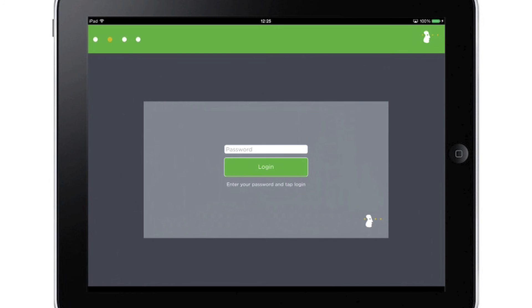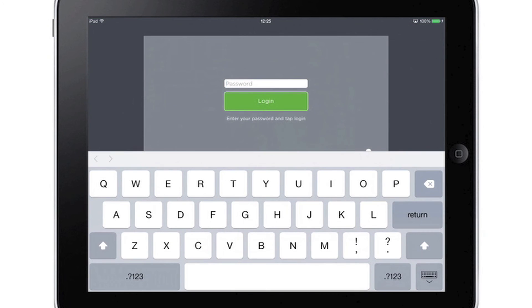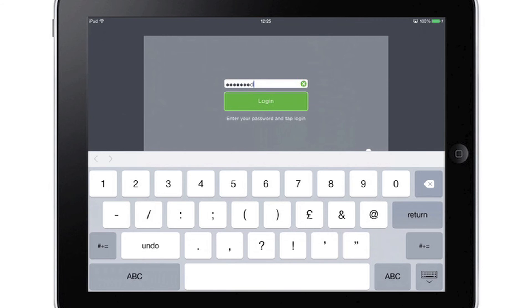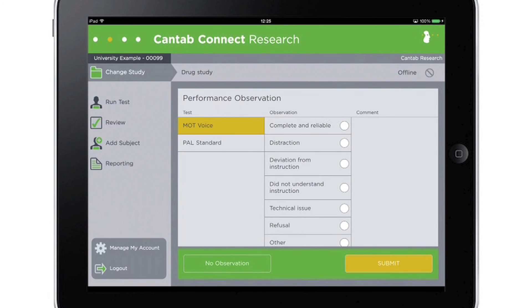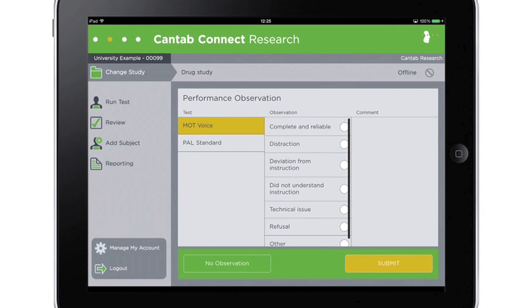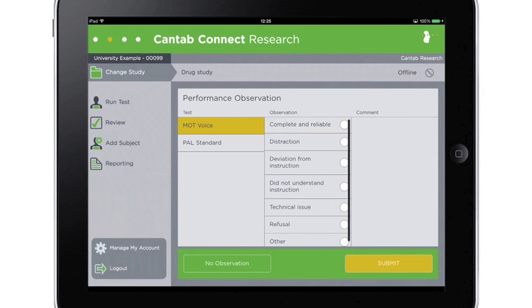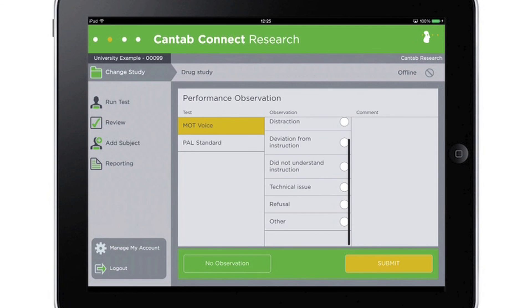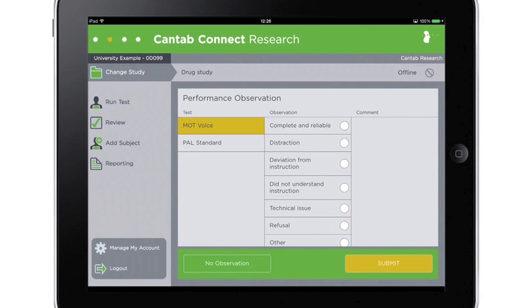Once the data has been collected, researchers can enter their password to access the data. The password protection prevents subjects or unauthorized users from accessing the data. Study results are automatically scored, stored, and ready for analysis immediately after collection.